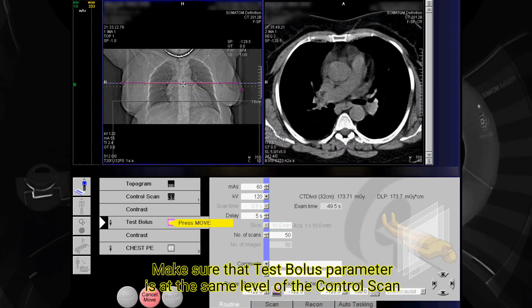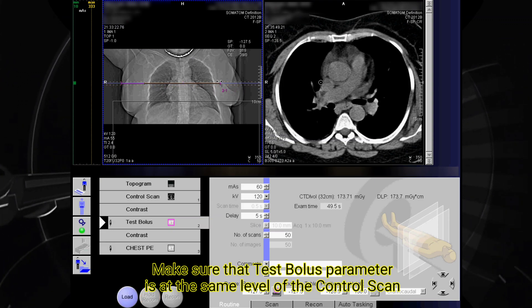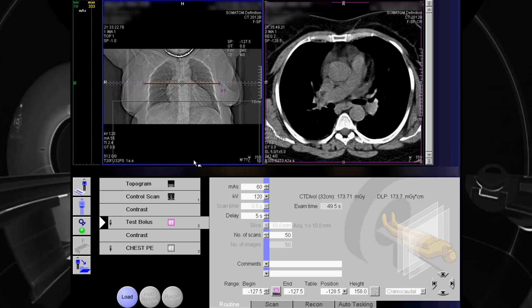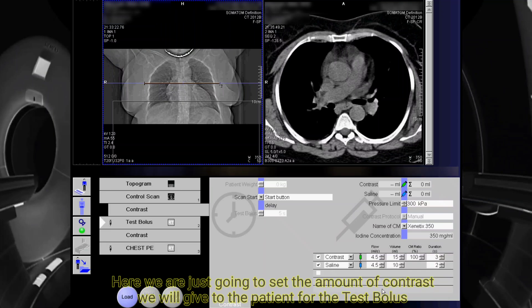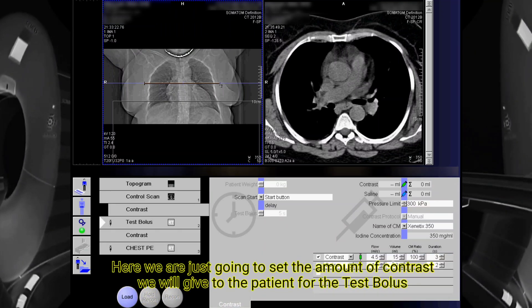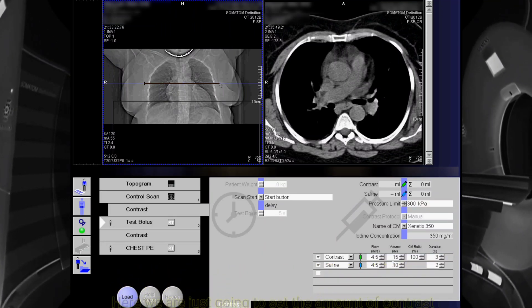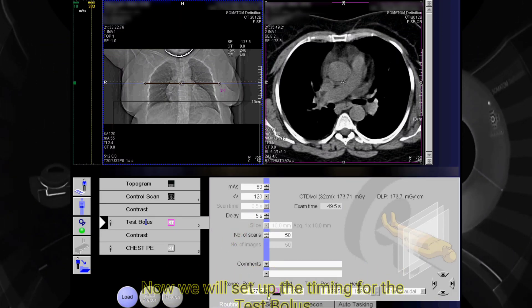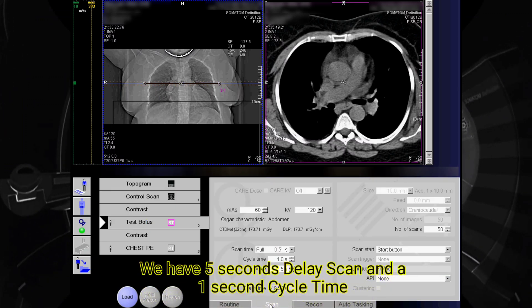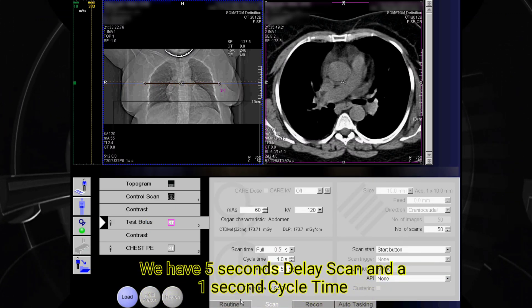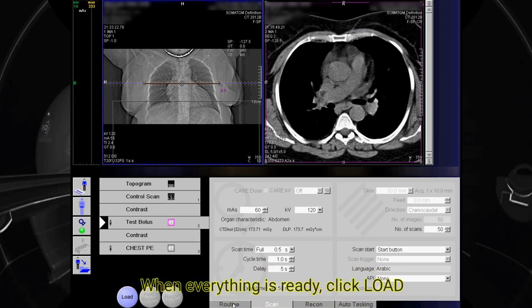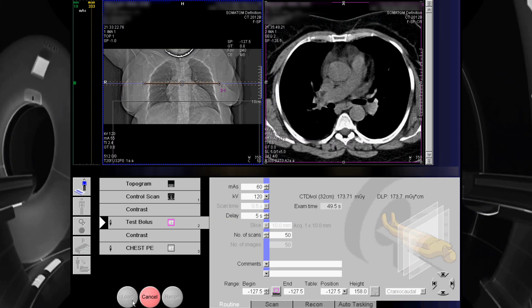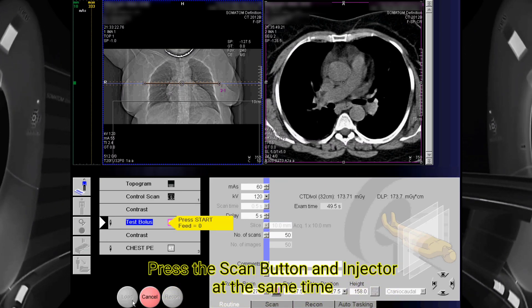Make sure the test bolus parameter is at the same level as the control scan. Here we are just going to set the amount of contrast we will give to the patient for the test bolus. Now we will set up the timing: we have 5 seconds delay scan and a 1 second cycle time. When everything is ready, click load. Press the scan button and injector at the same time.